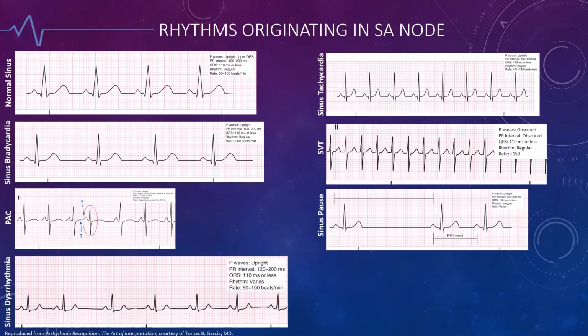Premature atrial contractions mean that you were going along in sinus, and then you have a little squiggle somewhere either in or right after the T wave, usually pretty pointy. And then you see another narrow, here's the key, narrow QRS after it. That's a premature atrial contraction that made it through the wiring and managed to trigger off another beating of the lower chamber. Okay? This is very different from a premature ventricular contraction.